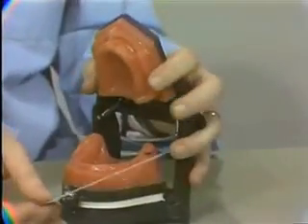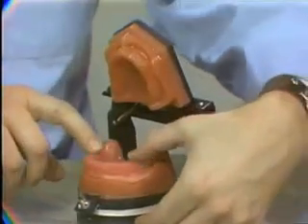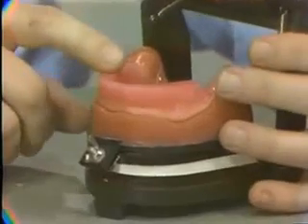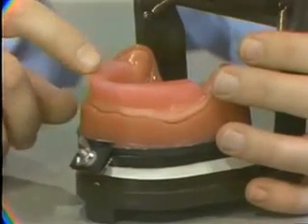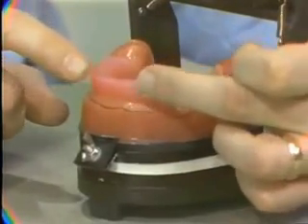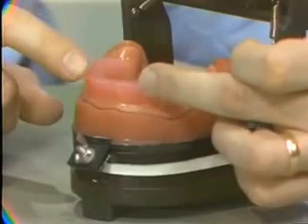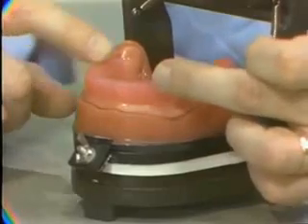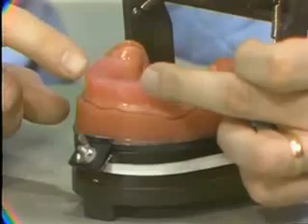Now, the next step is actually determining the vertical measurement of the patient's face when the future teeth are in contact, now that we have established the lower bite rim as we want. In the mouth, we use different criteria for this. For instance, the corners of the lips is a guideline. The wax rim is no higher than the corners of the mouth. If the wax rim is higher at about the right vertical, we know the lower rim is too high. It's kind of difficult to be too low, but it's easy to be too high.